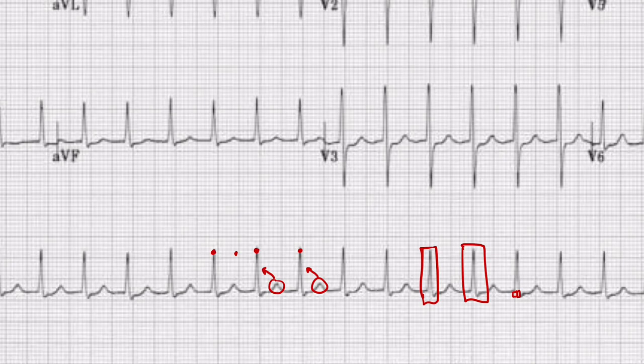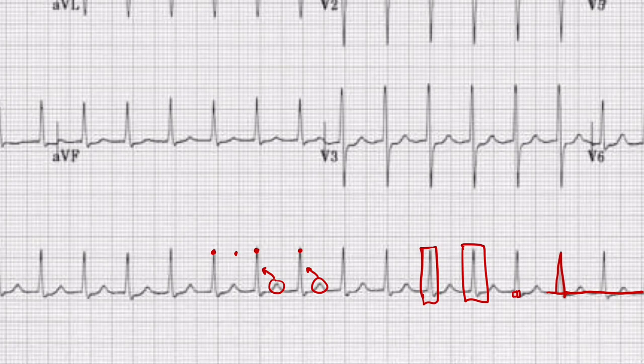Finally, we'll take a look at the ST segments. What I like to do is draw a line across the isoelectric line. We can see that after the QRS complex, the J point returns to the isoelectric line, and there's no ST elevation or depression here. So this is a normal ST segment.